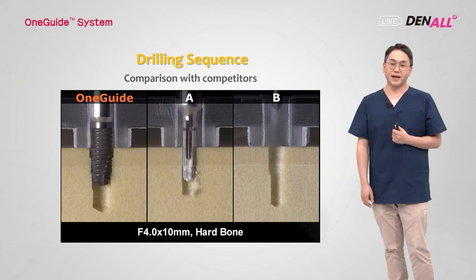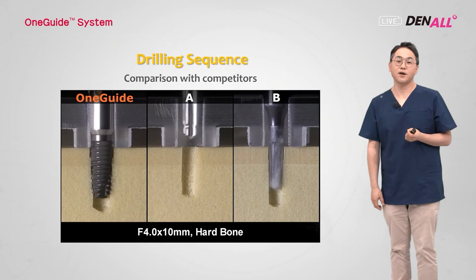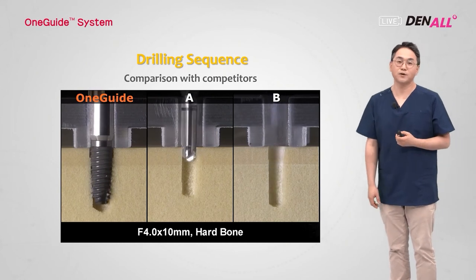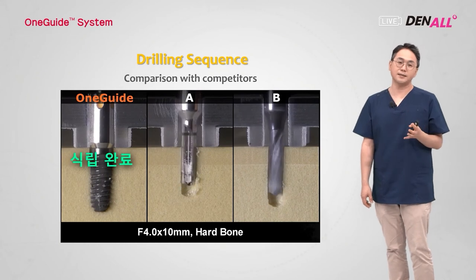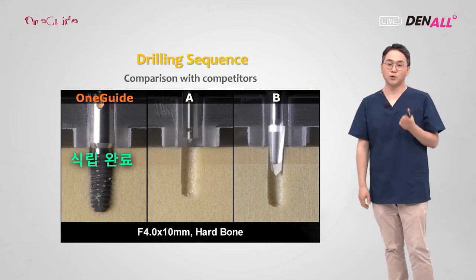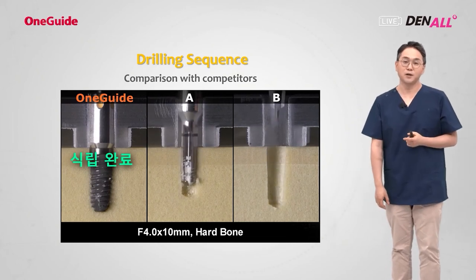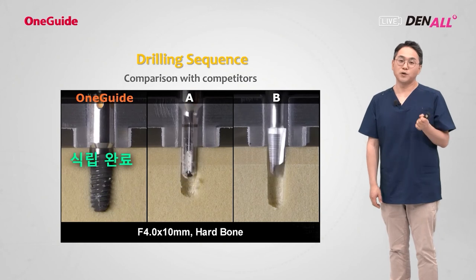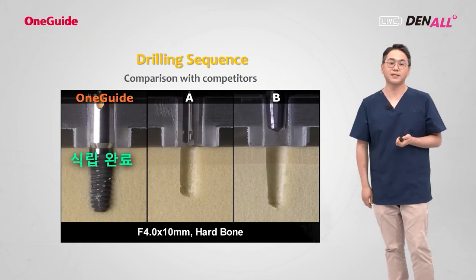The drilling sequence and the surgery time get long using many drills. Sometimes they use low-speed drilling due to the straight drills generating a lot of heat. During the procedure using a low speed, a patient should keep the mouth open for long. Low speed can reduce the heat generation, but compression damage can be a concern.